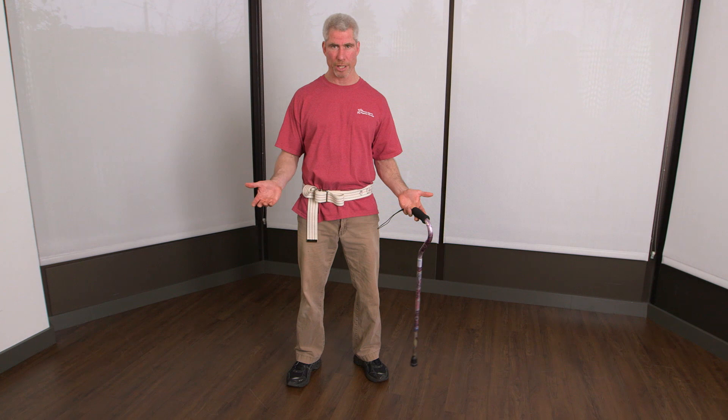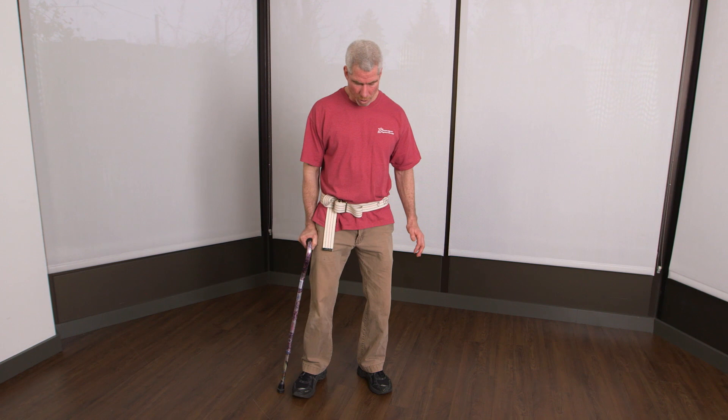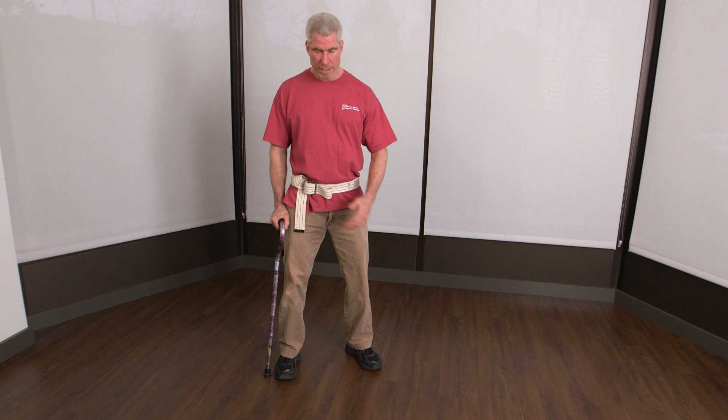Which hand do I want it in? Support means I'm supporting an injured leg. Let's say it's my left leg. I want that cane in the opposite hand over here, so I have a nice wide base of support between the two. If I put it on the same side, that doesn't feel very stable. On the opposite side, I can actually put some weight on it.